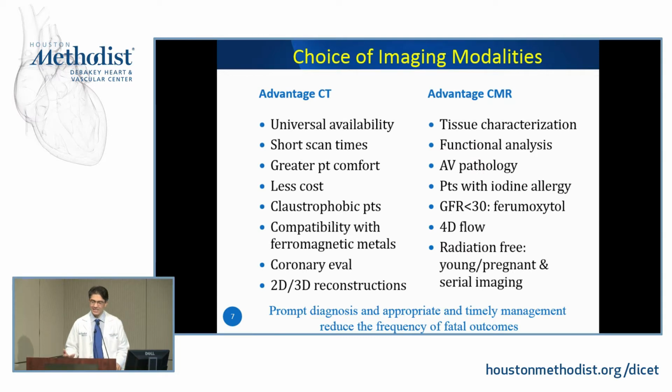But just some key things about the patient you should remember. CT is generally readily available in your ERs. It's got very short scan times. It's better for patients who are unable to lie flat for too long or claustrophobic patients. It doesn't have any problems with metal. May be helpful if you need to know the coronary evaluation as well.